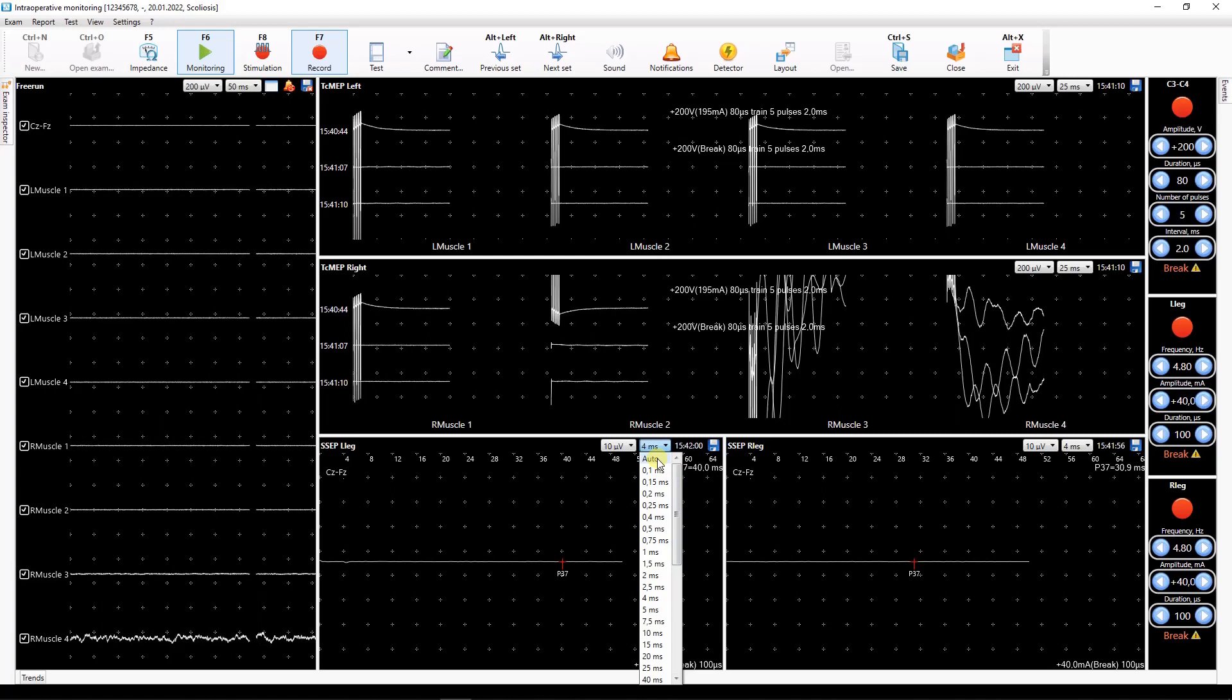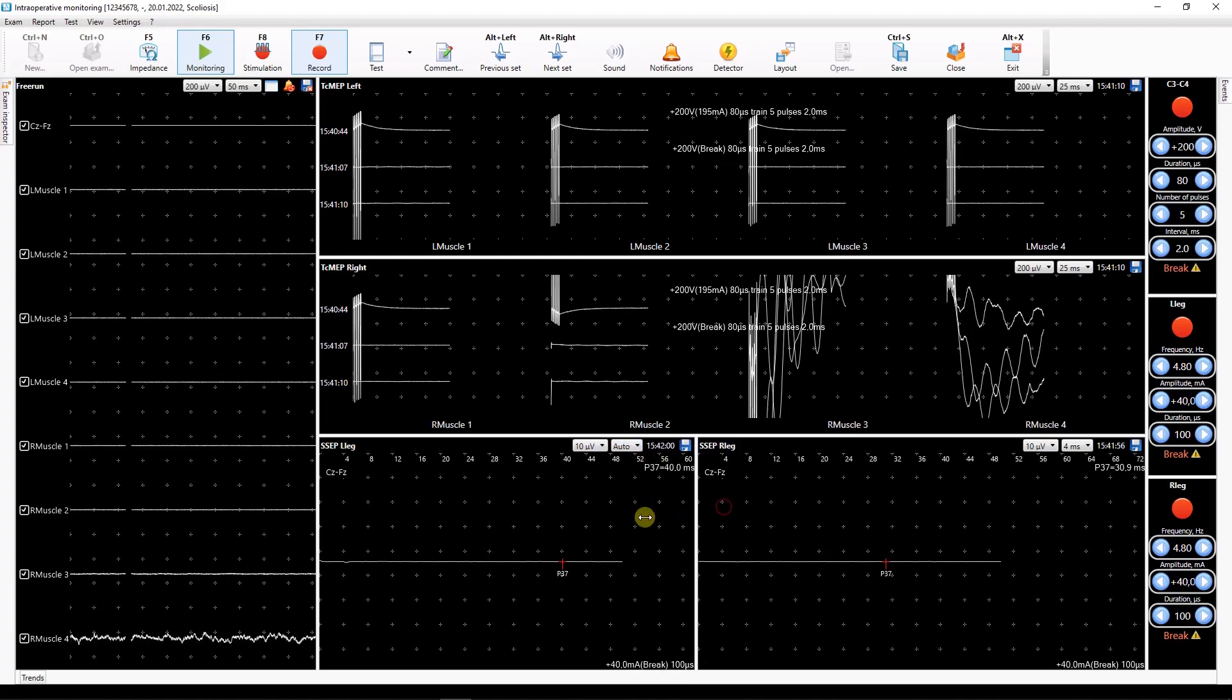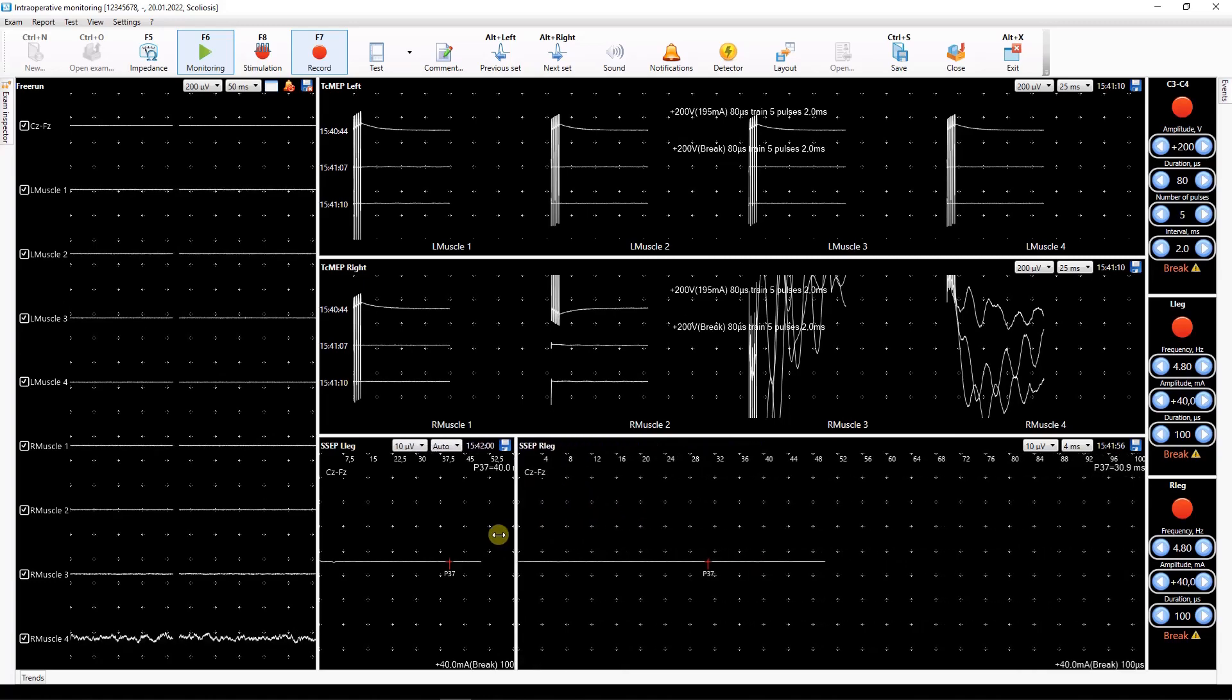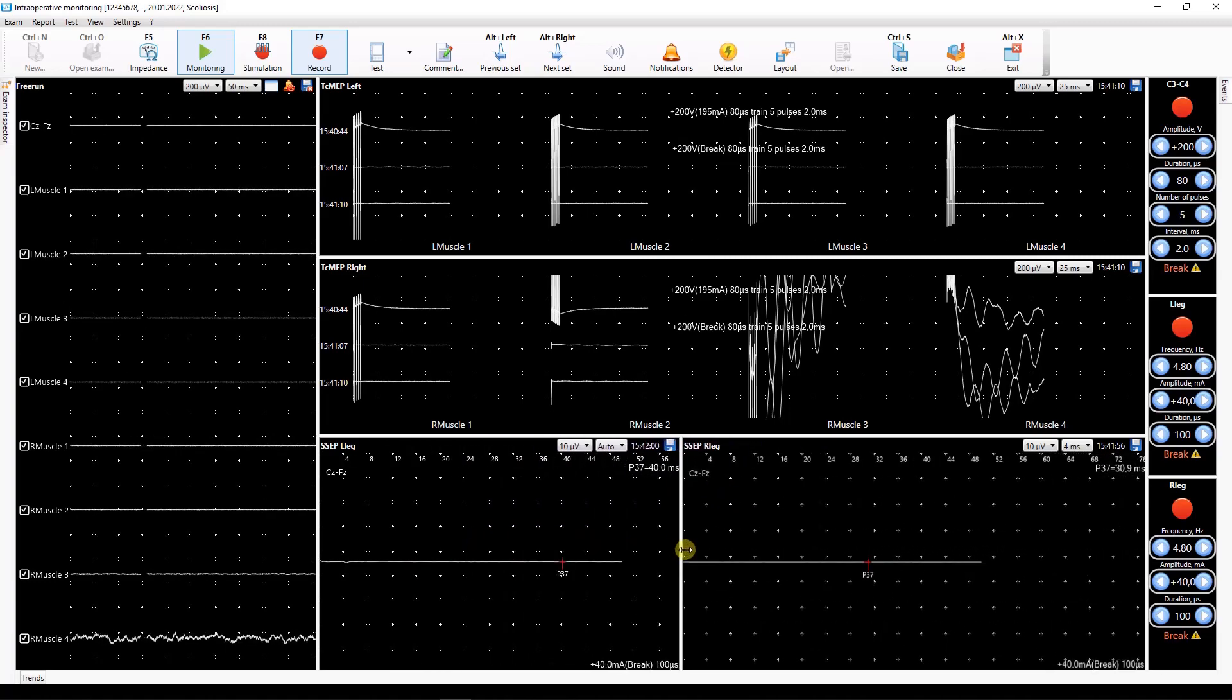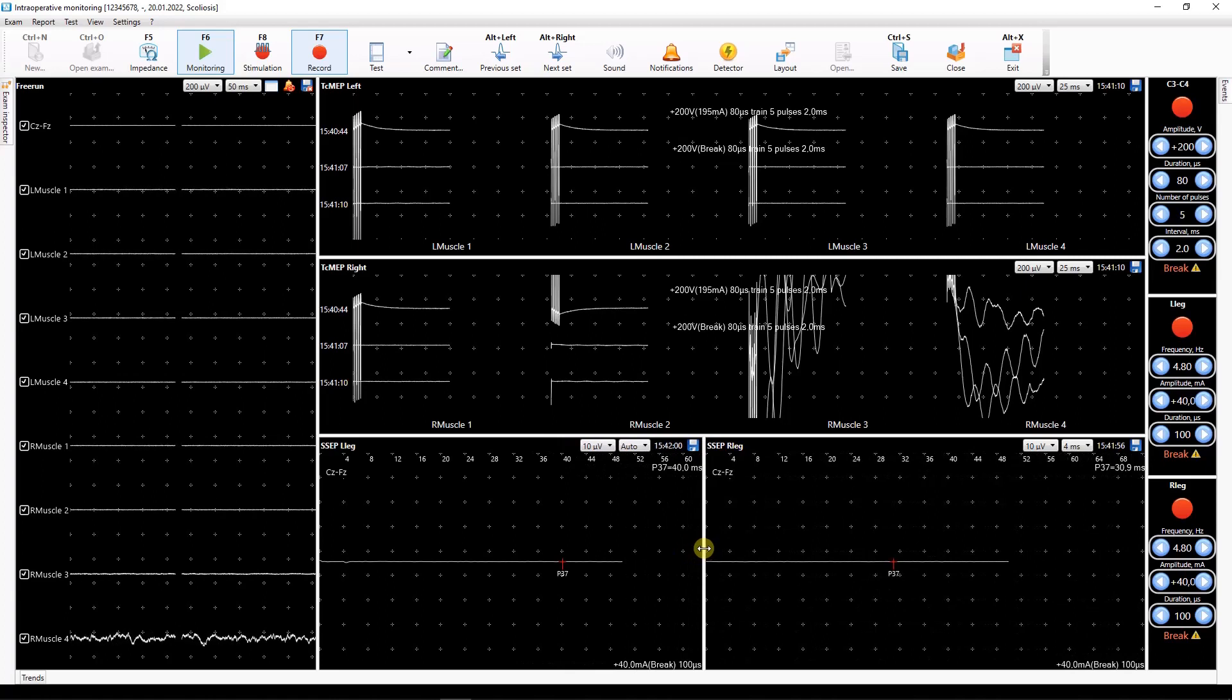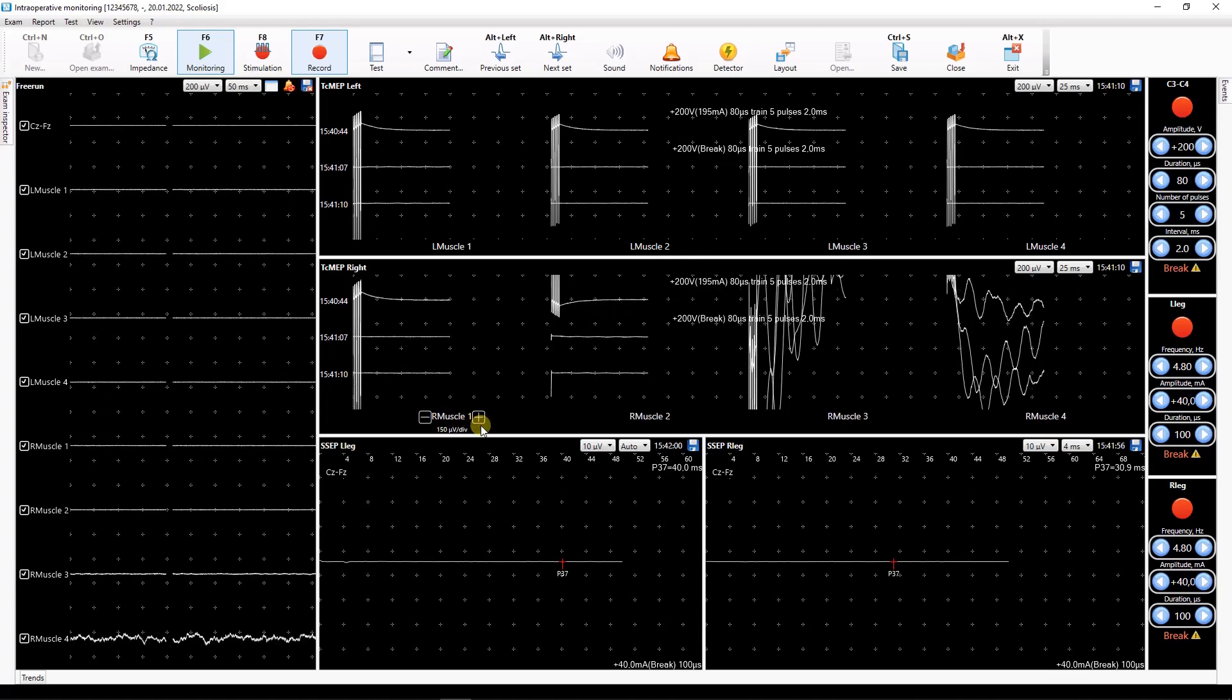When choosing a horizontal scale, auto mode, traces will be automatically adjusted depending on the size of the window. To change the scale of a particular trace, click on its name and use the appeared button to adjust it.